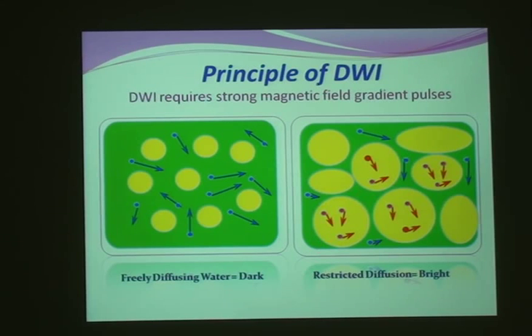So, what is the idea of diffusion weighted image? I'm just using imaging modality or sequences to reflect the microstructural environment we have as we go to the water. It just reflects to us if there is too much cells within this place or not. Cell packing just goes with malignancy, and that's it.